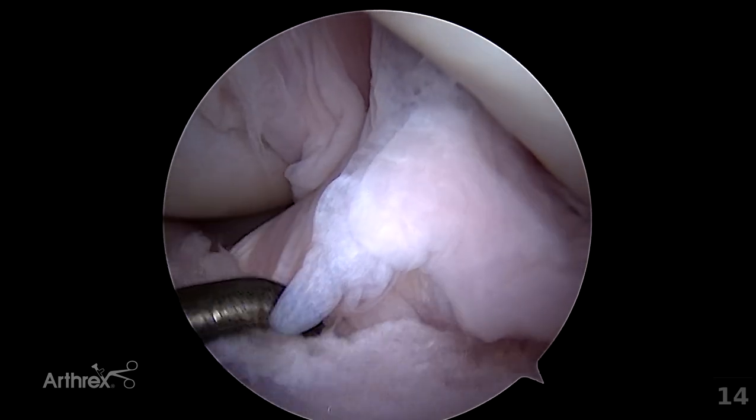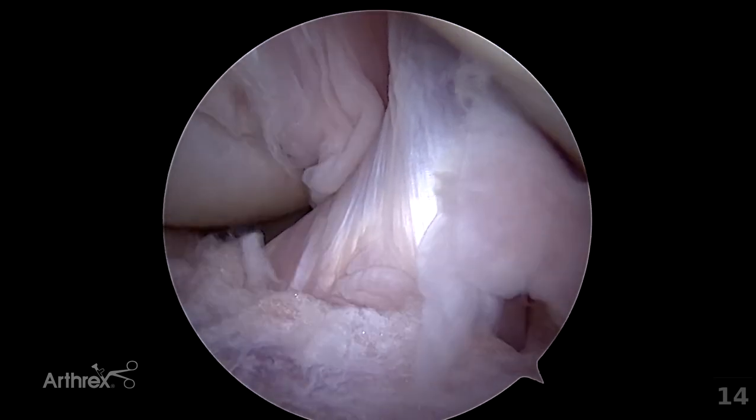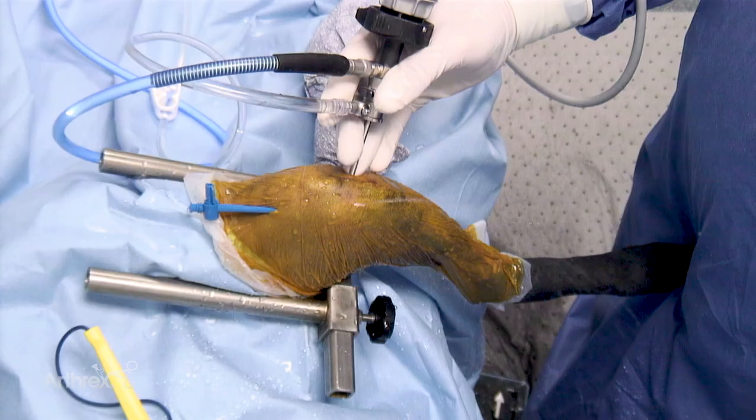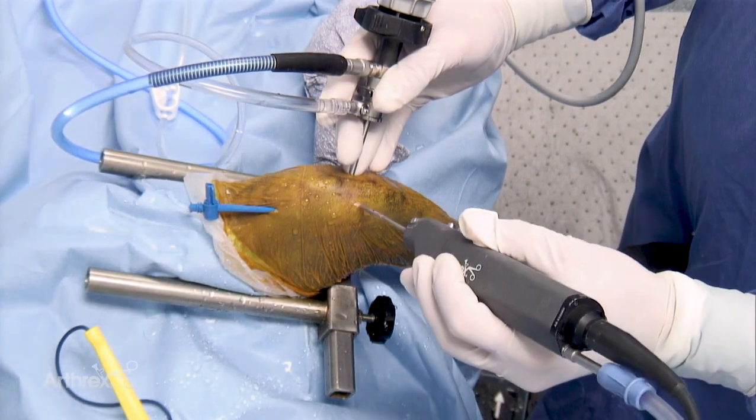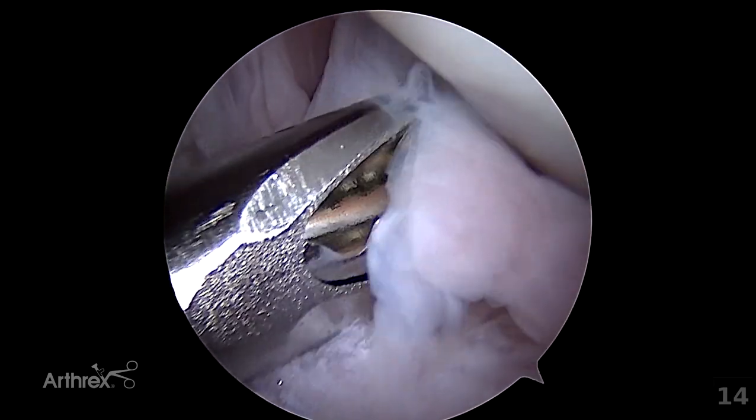Areas of intra-articular synovial proliferation or fat can be further addressed with use of the shaver. In tighter or more confined areas, downsizing the shaver is recommended. The use of the 3mm dissector is recommended at this stage. It has a slightly different tip and can be placed into tighter areas with ease.